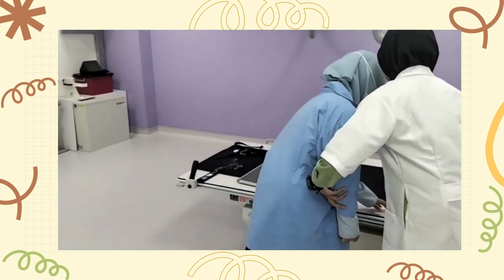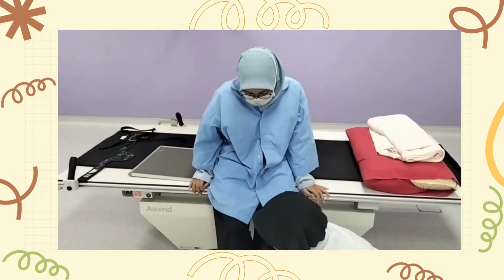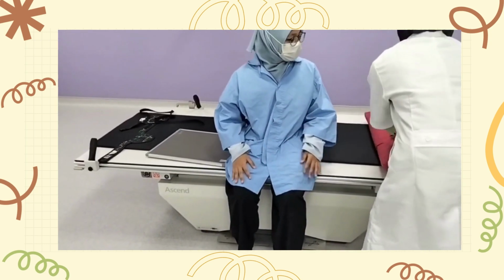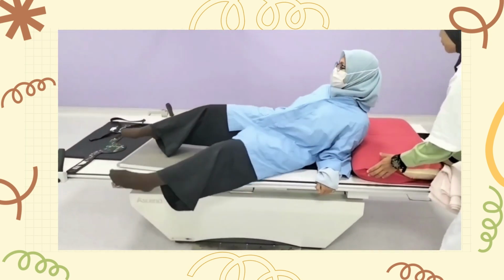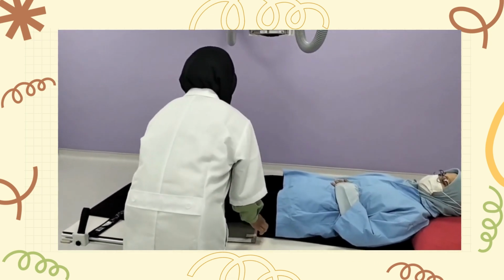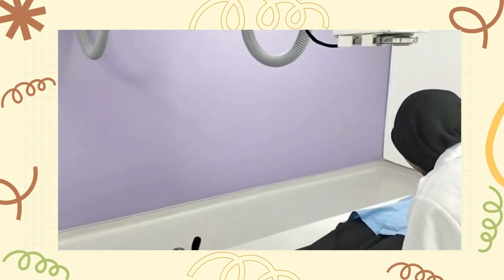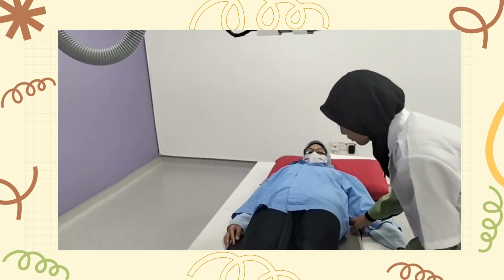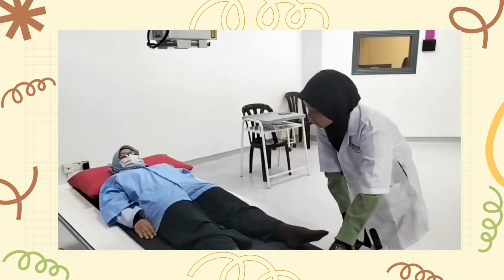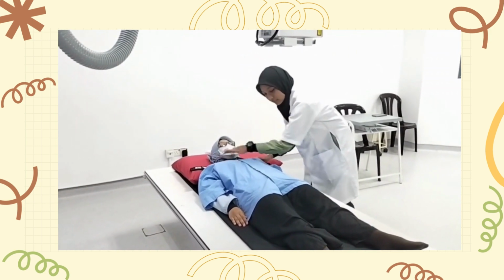Okay, sit here. Take off your shoes. Can you move your hips up a little bit? Okay, put it down. So we're gonna wear this protection to protect your thyroid, okay?